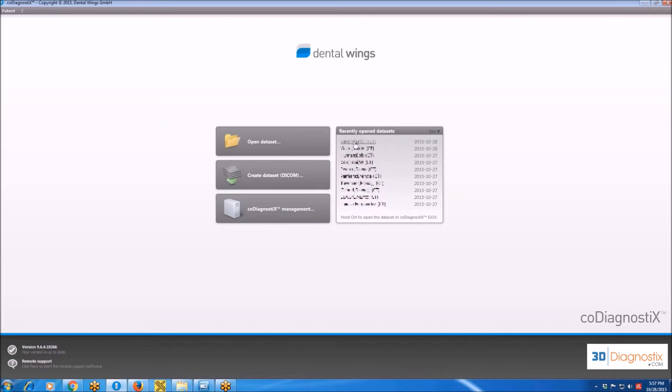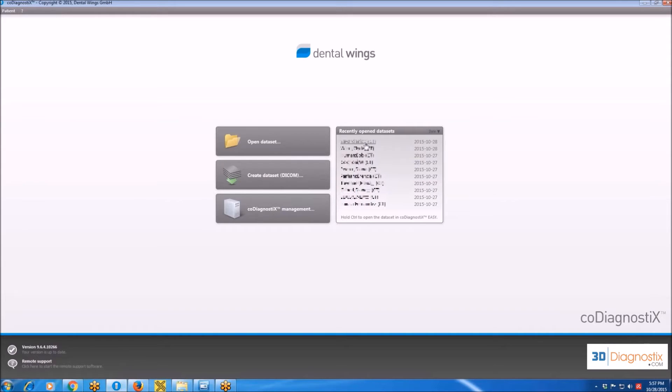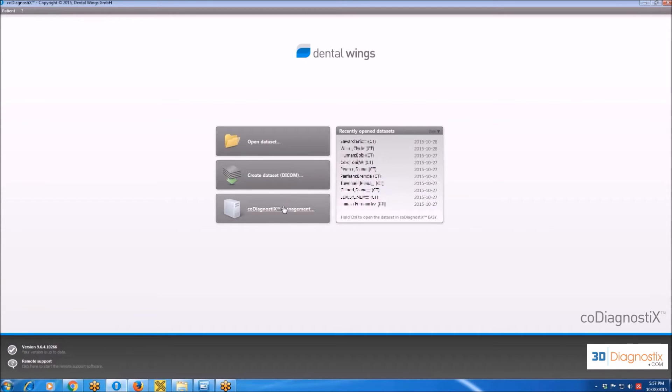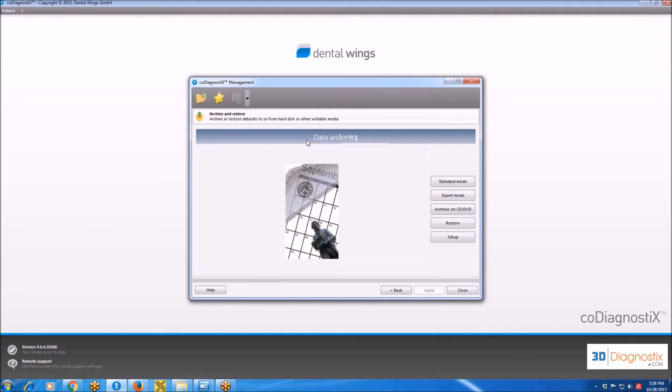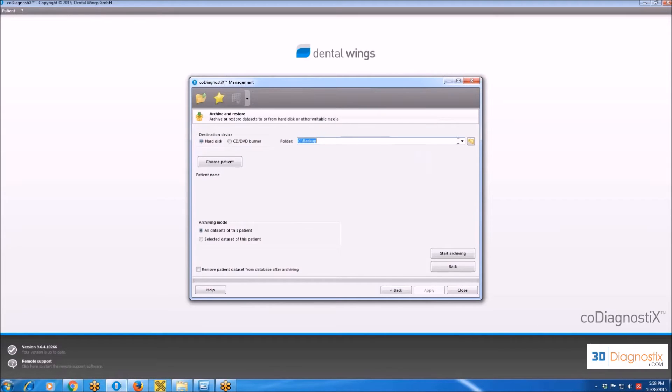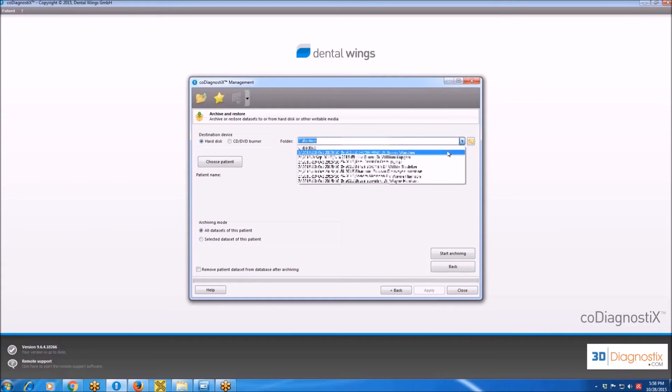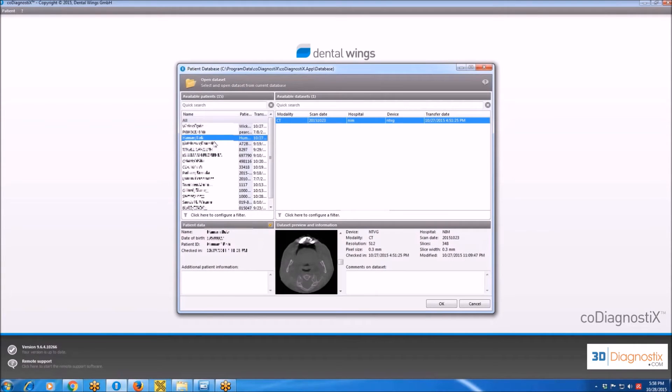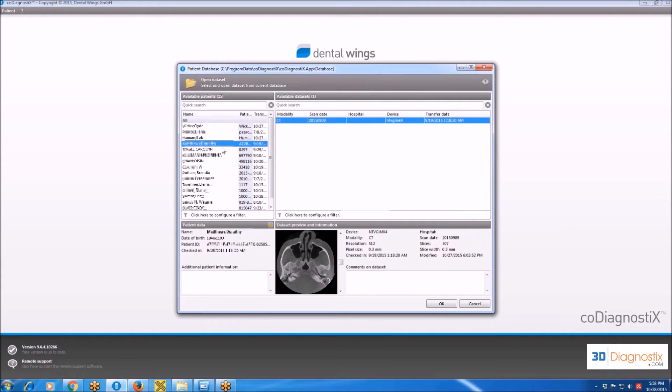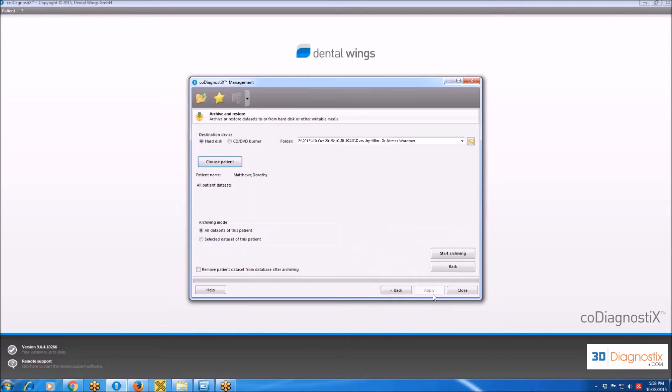Before entering the planning software itself, I am going to examine the last button over here, which is Co-Diagnostics Management. You can see here I have all patient datasets. If I want to save - so right now every dataset is saved in the planning software, but it's not saved on the computer hard disk. If I want to save in a specific folder on the computer, what I have to do is this: I'm going to archive the patient's dataset back to its folder on the computer. To do that, click on Co-Diagnostics Management, click on Archive and Restore, choose Standard Mode, choose the specific folder and then choose the patient. Then you click on Start Archiving and the dataset will be saved in that folder.